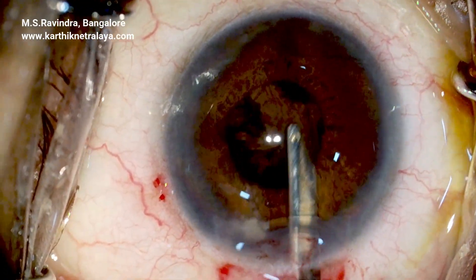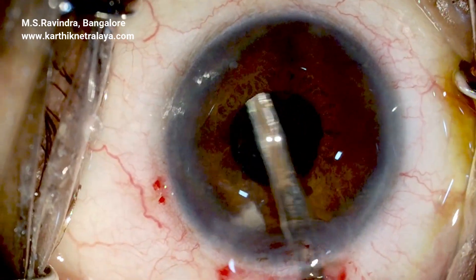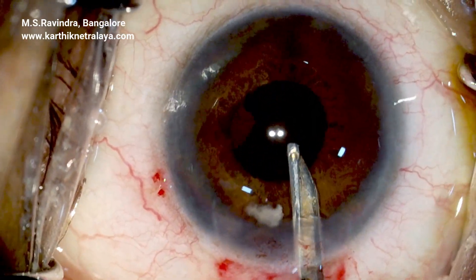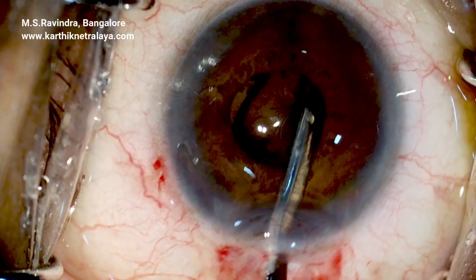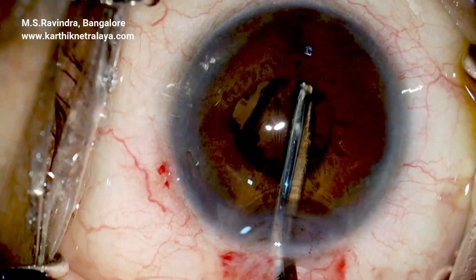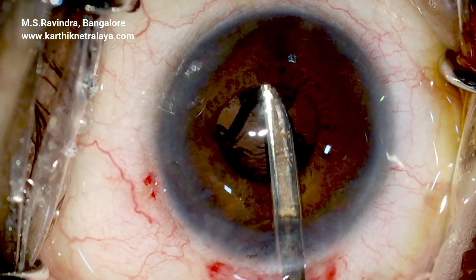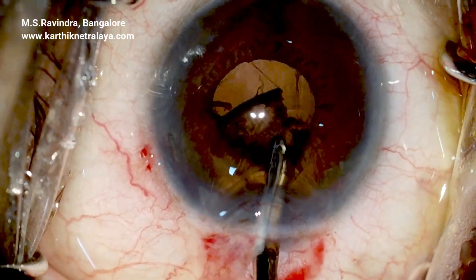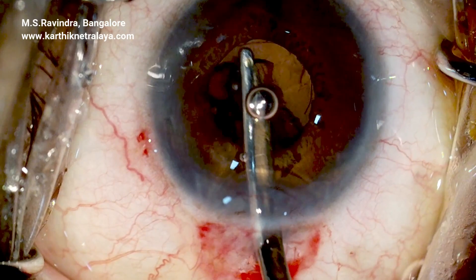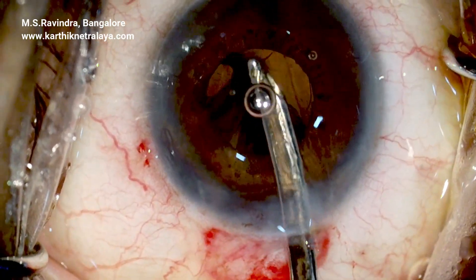The cortex is aspirated very carefully, with extraordinary care taken at the place where the rhexis ran off — on the left side of the field — using a Simco cannula attached to a 5 mL syringe. Aspiration is performed while infusion is continuous and controlled by visual guidance to maintain the chamber.